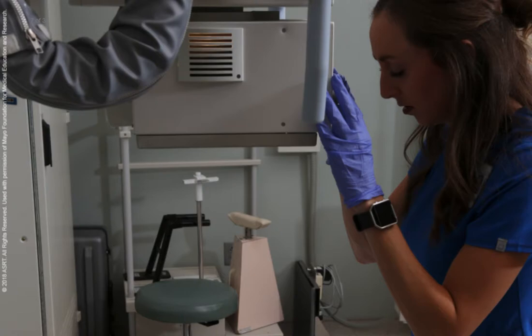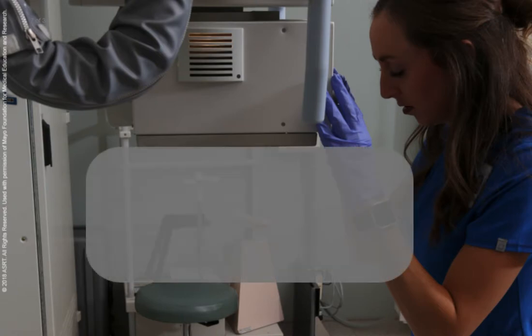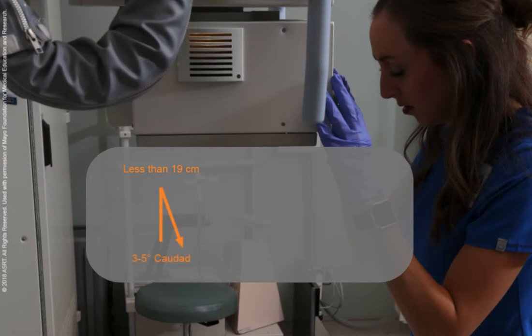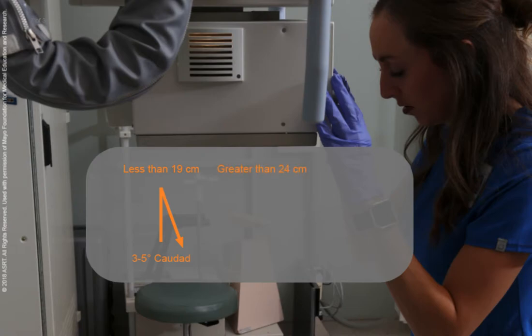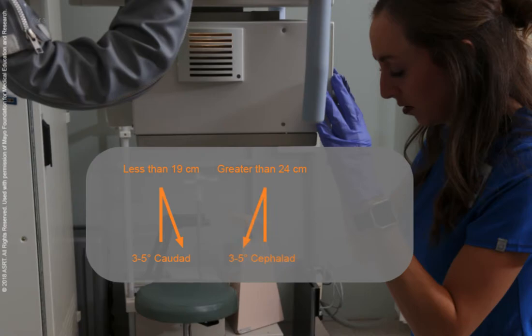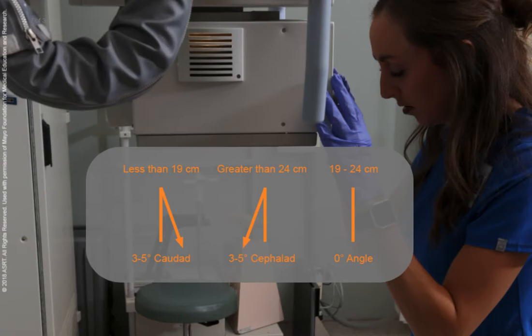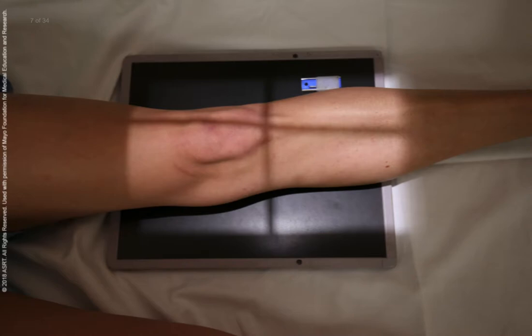The proper central ray angle is dependent on the thickness of the patient's pelvis, measured as the distance between the ASIS and the radiographic table. For patients with a thinner pelvis less than 19 cm, the central ray is angled 3–5 degrees caudad. For patients with a thicker pelvis greater than 24 cm, the central ray is angled 3–5 degrees cephalad. No angle is used when the pelvis measures between 19 and 24 cm. For all patients, the central ray is directed to the knee joint and enters at a point half inch inferior to the apex of the patella.